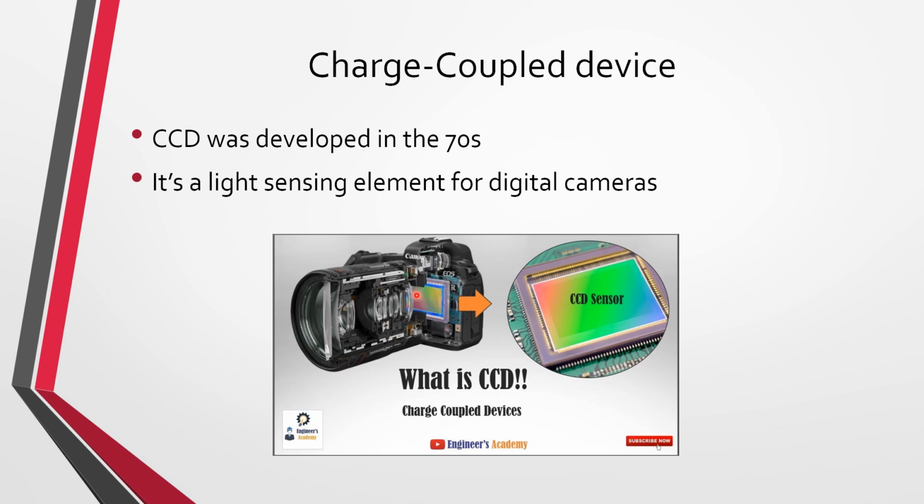Okay, this is what is actually picking up the light in digital cameras, and all we're doing is adding much more complexity and much more accuracy, because we need to be much more accurate in medical applications. We're just adding an extra layer by starting with x-rays instead of light, but we're making it light.